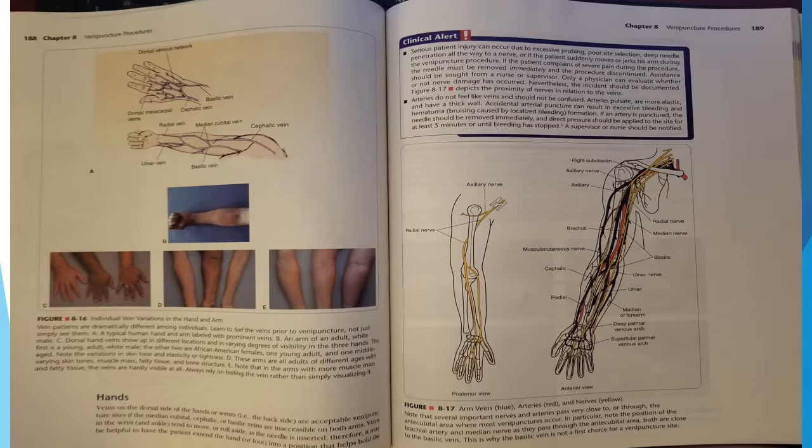Figure 8-17 depicts the proximity of nerves in relation to the veins. Arteries do not feel like veins and should not be confused. Arteries pulsate, are more elastic, and have thick walls. Accidental arterial puncture can result in excessive bleeding and hematoma, which is bruising caused by localized bleeding. If an artery is punctured, the needle should be removed immediately and direct pressure should be applied to the site for at least 5 minutes or until the bleeding has stopped. A supervisor or nurse should be notified.